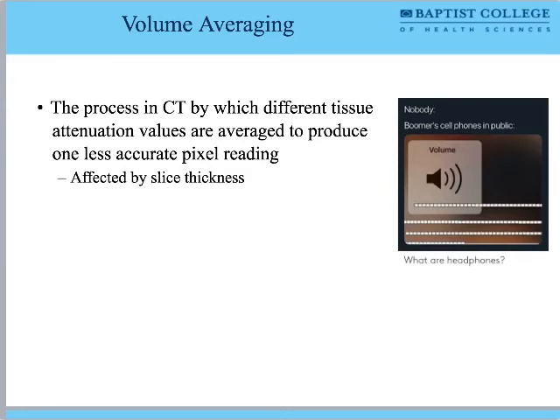Is there just a general thickness that's used, or does it vary depending on what you're scanning for? Awesome question. Yes, it will vary depending on what we are looking for. CT techs are nerd level interested in why we are doing this procedure. What are we looking for? Because if you just say CT abdomen, that tells me nothing. Is it a CT abdomen for kidney stones? For kidney cancer? For pancreatitis? Those are three different exams. CT abdomen tells me the volume, but it didn't tell me how that volume should be averaged.